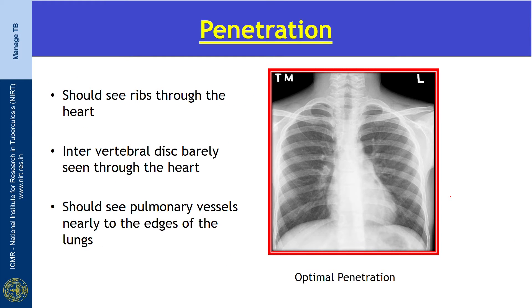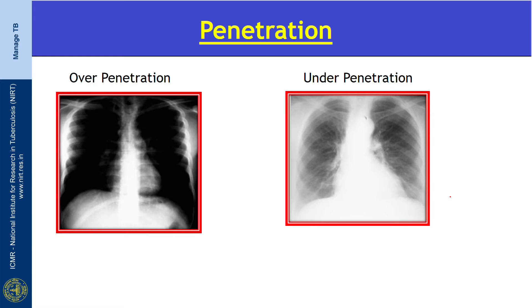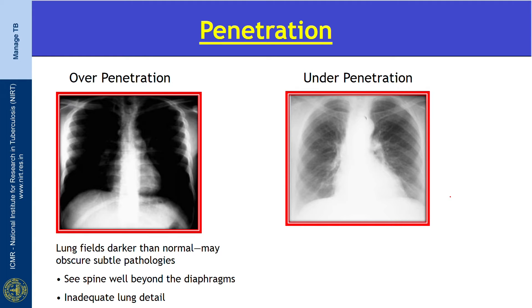Coming to penetration — penetration is the degree to which the X-ray has passed through the body. In an optimally penetrated X-ray, you should be able to see the ribs through the heart. The intervertebral discs should be barely seen through the heart and you should also be able to see pulmonary vessels nearly to the edges of the lung. This X-ray shows an over-penetrated film — the lung fields are darker than normal, which may obscure subtle pathologies. You can see the spine beyond the diaphragm, leading to inadequate lung detail. Over-penetration leads to underreporting.